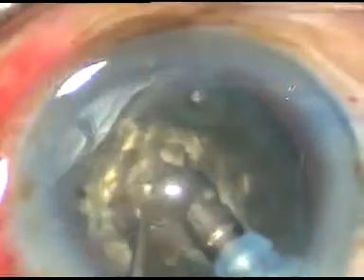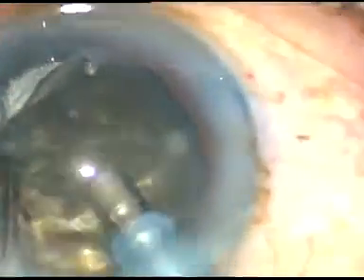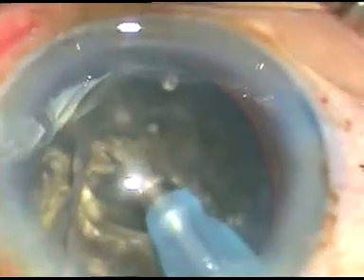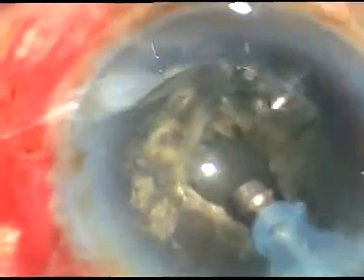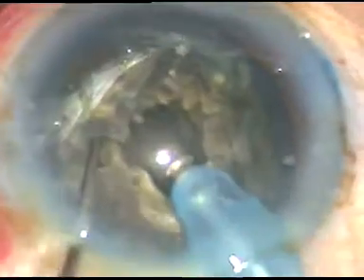What I am doing is making a crater in bevel-down position of the phaco tip. Because if it is bevel-down, occlusion becomes easy and more lens mass from the nucleus can be sculpted out by each application of energy. After going to sufficient depth, I then make the bevel up and do some more sculpting.